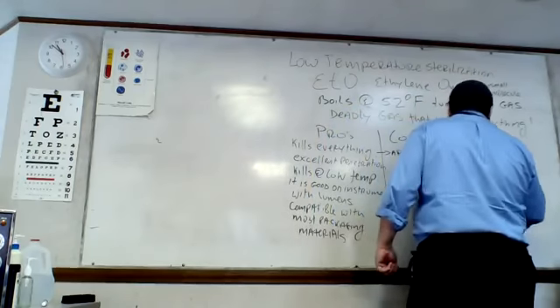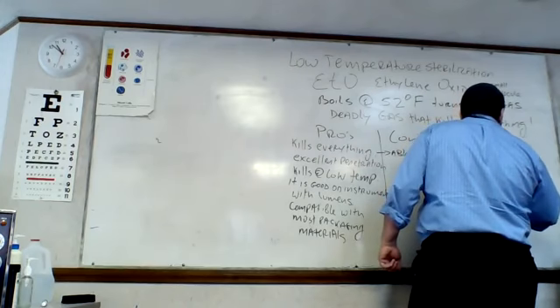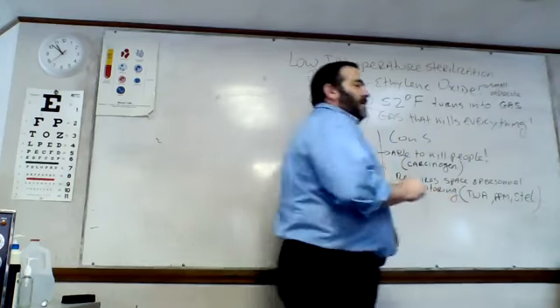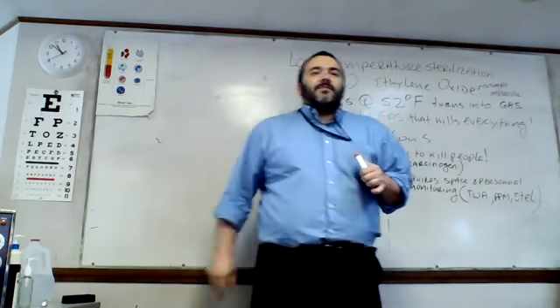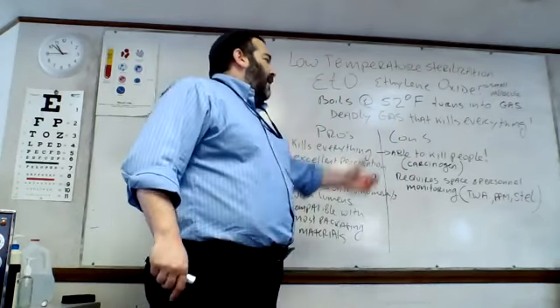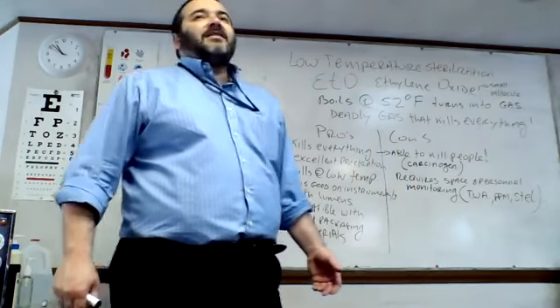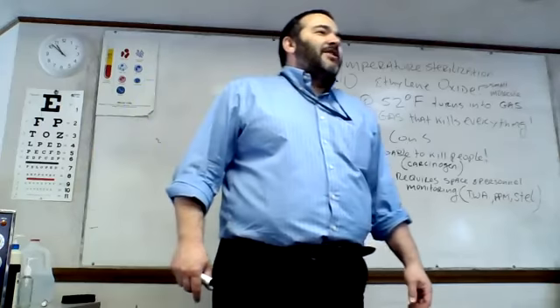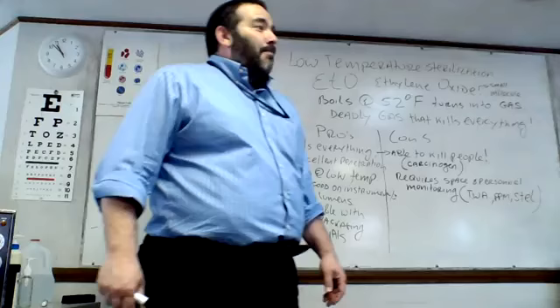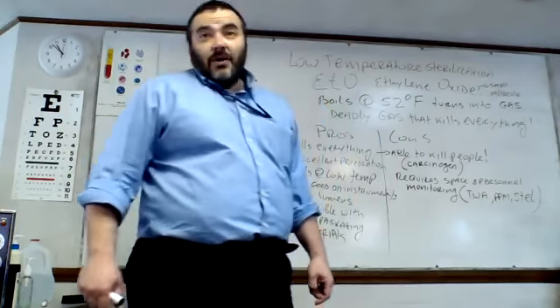And we'll get into things like TWA, PPM, STEL. We'll talk about this a little bit later. So if it talks about the space and personnel monitoring, we're also talking about things like OSHA, Occupational Safety and Health Administration, being heavily involved in its monitoring, and we have to be responsible for their oversight. Okay, make sense?